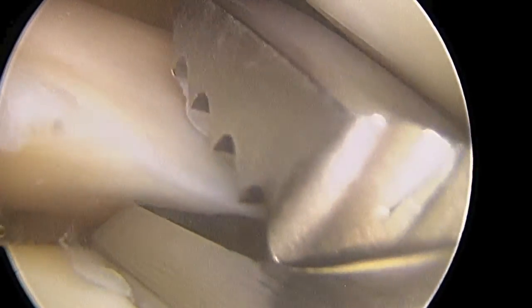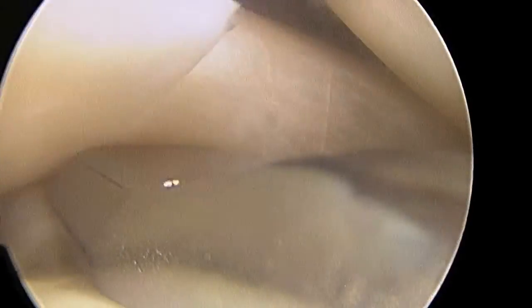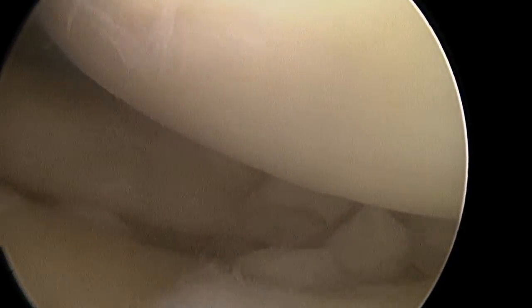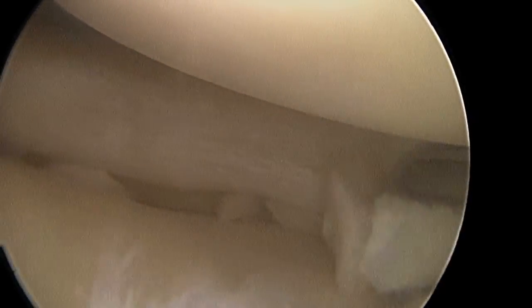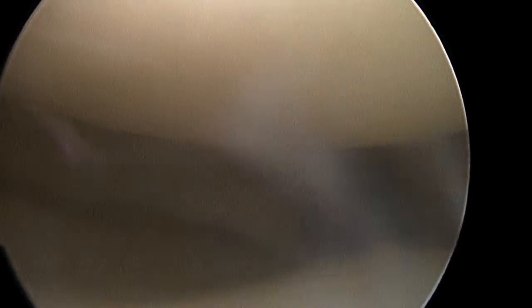Here we have a video of a partial meniscectomy. Using an arthroscopic biter, I'm removing a portion of the meniscus. What I've done is removed the meniscal tear and now I'm beveling it back to a smooth rim so that the meniscus no longer becomes entrapped in the joint. Here you see an arthroscopic shaver coming into view, which I'll use to remove any fragments of meniscus and smooth up the edges until I'm happy with the resection.